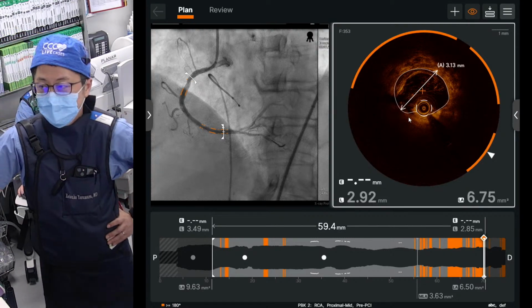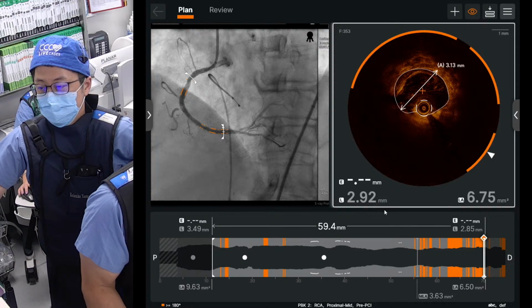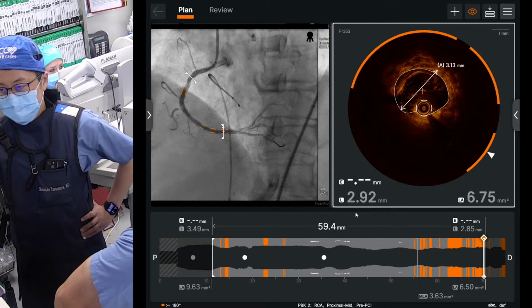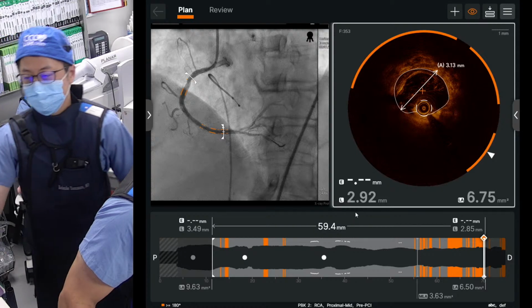Then, what do you want us to take? We'll take a 3-5-48 first, and proximally we put a 4-0. 3-5-48 first, sounds good. Anyway, total lesion length is 59. Yeah, so we are going to use 48 plus 18. That's correct. That's good math.